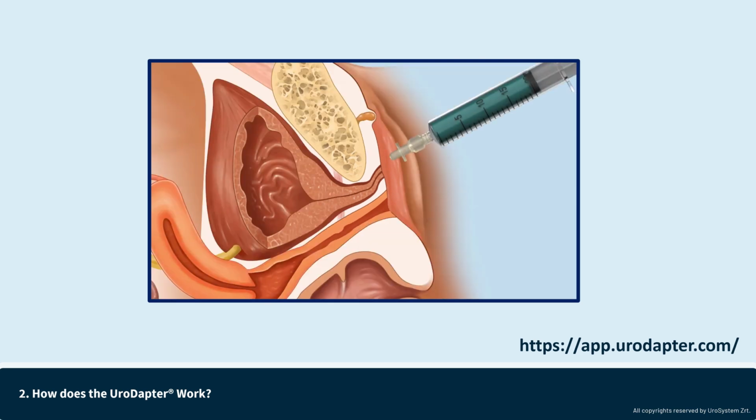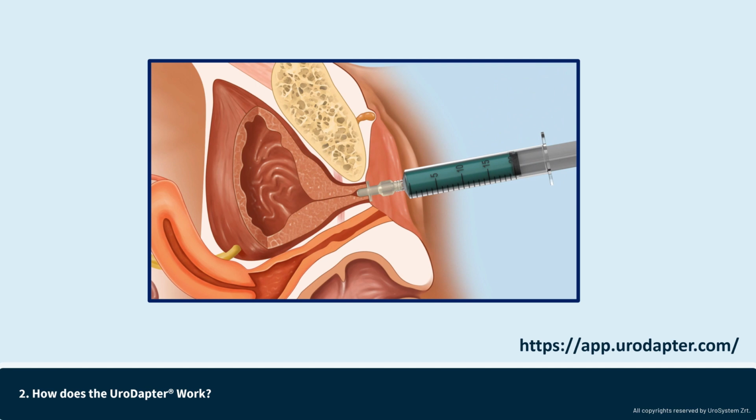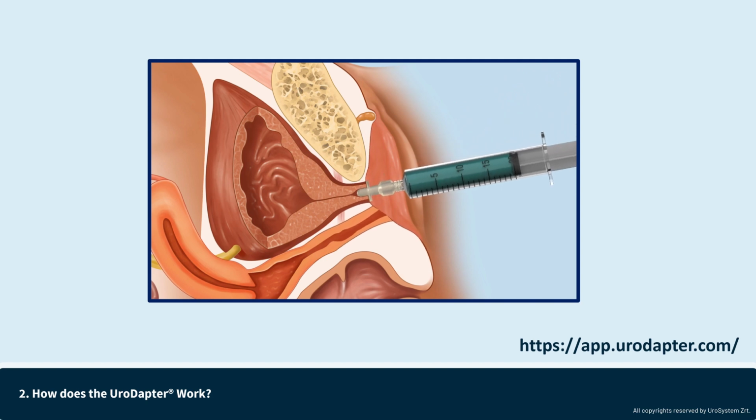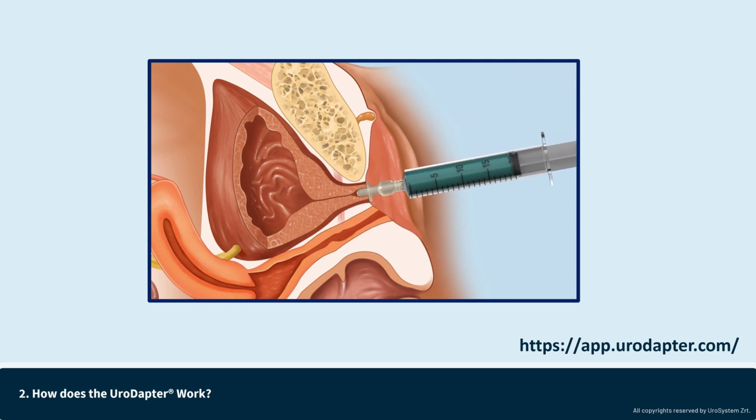Then, for the same purpose, as we insert the UroDapter in the orifice, we gently drive the syringe with a spooning motion under the symphysis. Doctors or practitioners performing regular female catheterization or cystoscopy are familiar with this spooning motion, as this is necessary to bypass the pelvic bone.